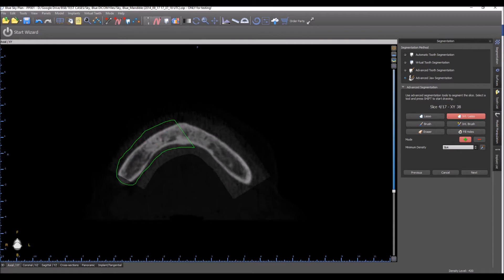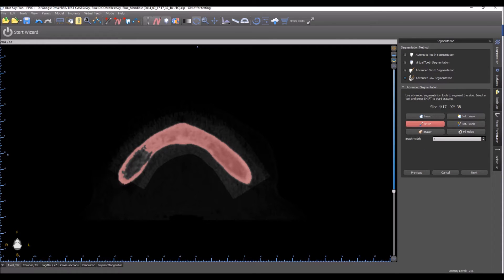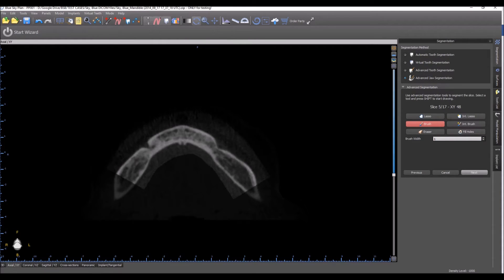The area on the screen that looks a bit brighter is the area that we defined by drawing the rectangle in the first step. Here this area isn't completely closed off, which is why the fill holes tool didn't fill it in. So we're going to go to brush and fill that, then click fill holes and it's completed.